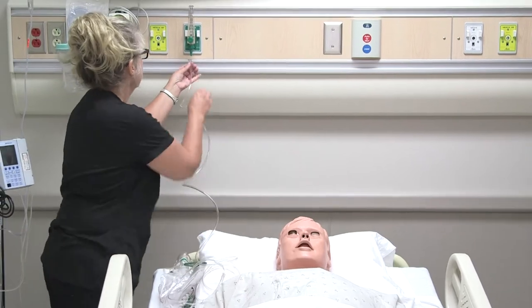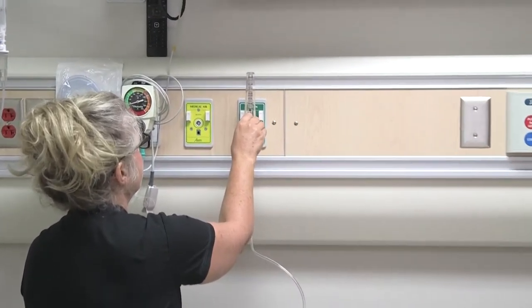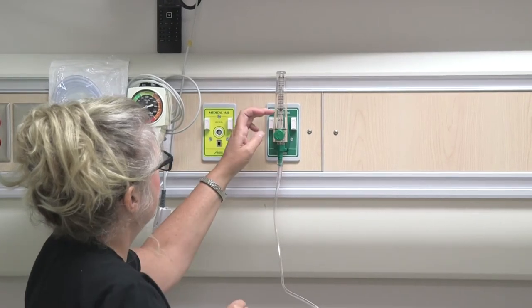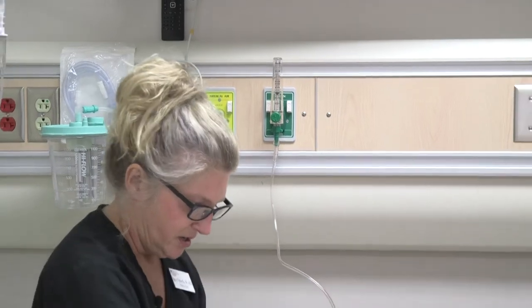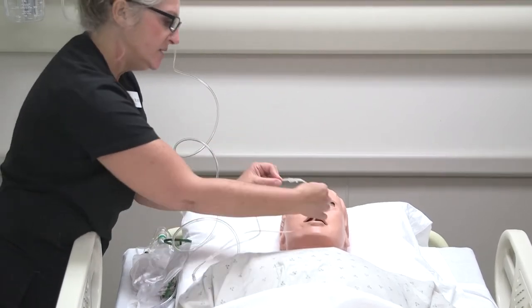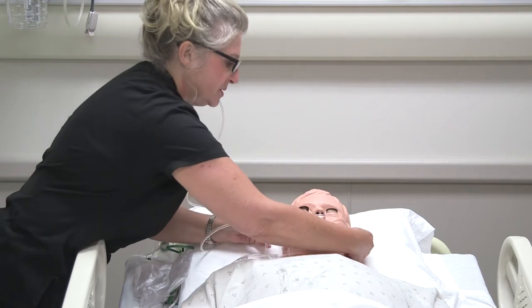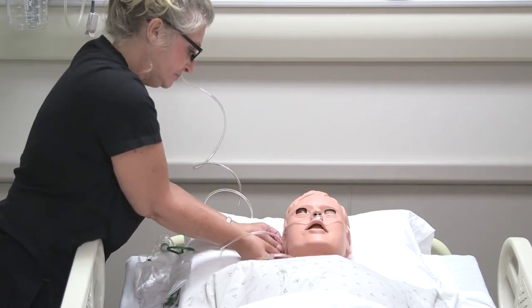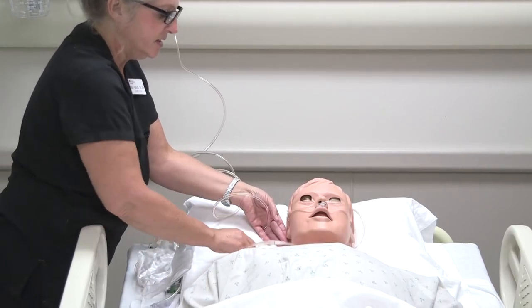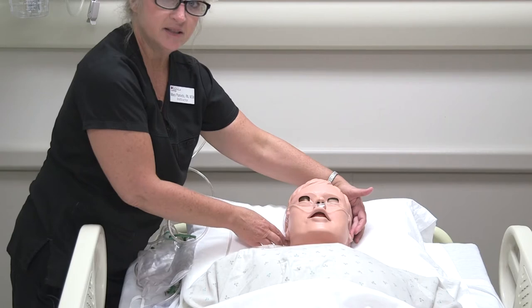I'm going to go ahead and plug this into the flow meter here. Since it's a low flow, we can set it anywhere from two to six. A real common level is at two, so we're going to set our oxygen there. You want to make sure the little ball is right in the middle of the two. Then we're going to go ahead and place this on the patient. You can tell that these prongs are downward — you want to put them in downward because that's how the air is going to flow down into the nose and into the trachea. Place them in, make sure they're positioned downward, go around the ears. You don't want it too tight, but tight enough where it's not going to keep coming off. That's how you would place the nasal cannula.